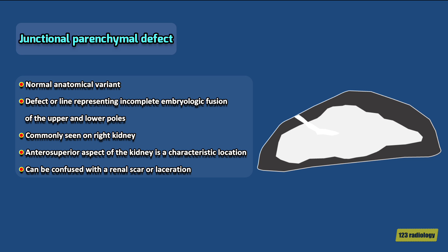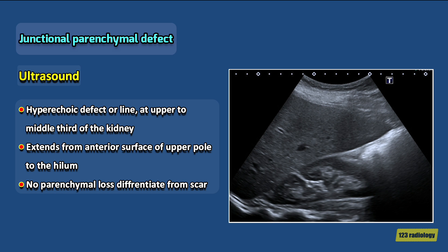Junctional parenchymal defect is a normal anatomical variant of the kidney. It is a defect or line representing incomplete embryologic fusion of the upper and lower poles of the kidney. This normal variant is more commonly seen on the right kidney. The anterosuperior aspect of the kidney is a characteristic location for junctional parenchymal defect. This anatomical variant can be confused with a renal scar or laceration. On ultrasound, junctional parenchymal defect appears as a hyperechoic defect or line at the upper to middle third of the kidney, extending from the anterior surface of the upper pole into the hilum. No associated parenchymal loss is a useful sign to differentiate this normal variant from cortical scar.